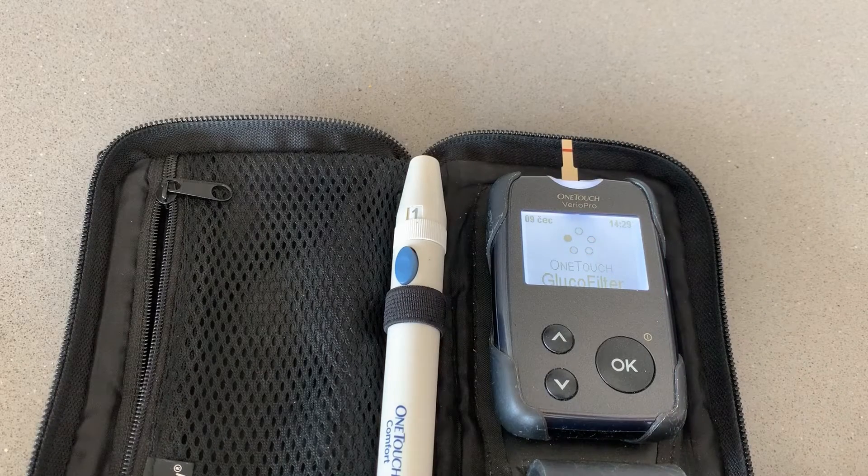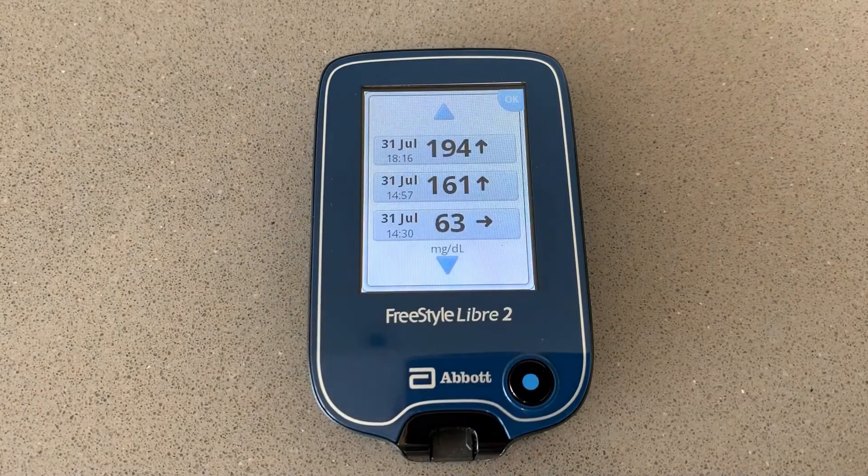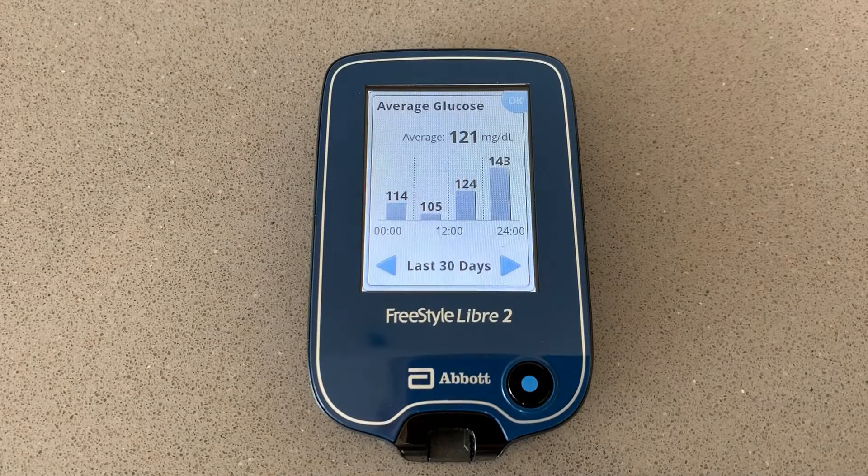Thank you. In the past 4 weeks I went through a huge testing challenge using Libre 2, Libre 1, and finger pricking — more than 380 blood sugar tests to find out how accurate Libre 2 really is. I used two Libre 2 sensors, both placed on my upper arm as recommended by Abbott, and both lasted the full 14 days. Each day of the tests I did at a minimum 4 readings using 3 different tools: Libre 2, Libre 1, and a glucometer — OneTouch Verio Pro. Then I compared, analyzed, and assessed the results from all 3 sources.